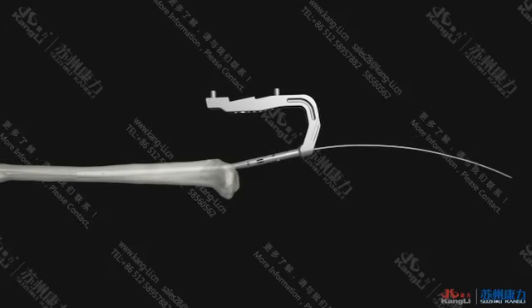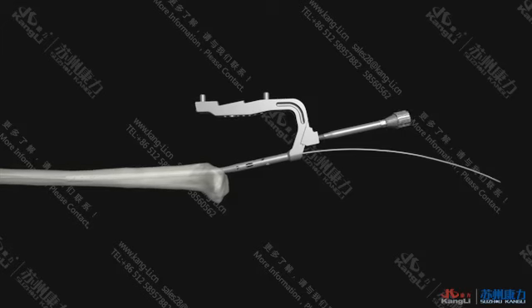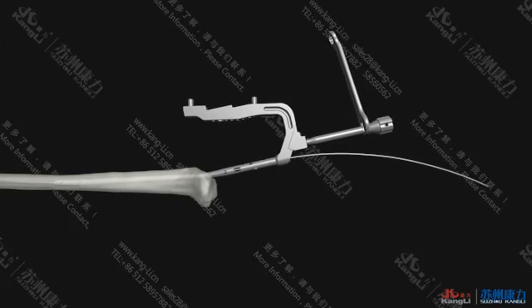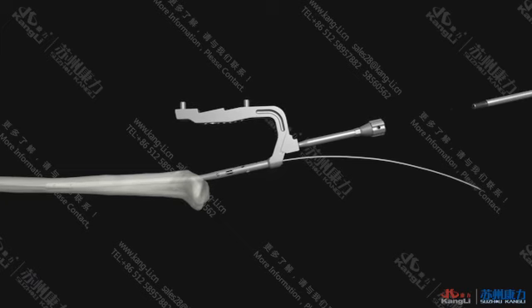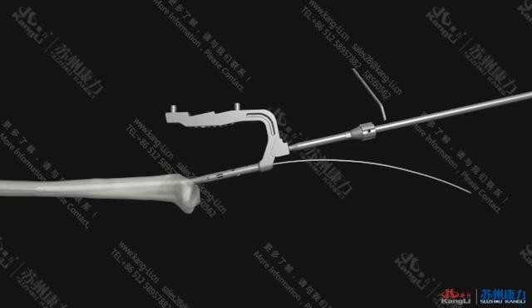If no key entrance is needed, install the nail leg connector on the groove of the holder and tighten it with an open end wrench at first. Then connect it with a slide hammer guide bar and gently knock the nail in with the slide hammer.